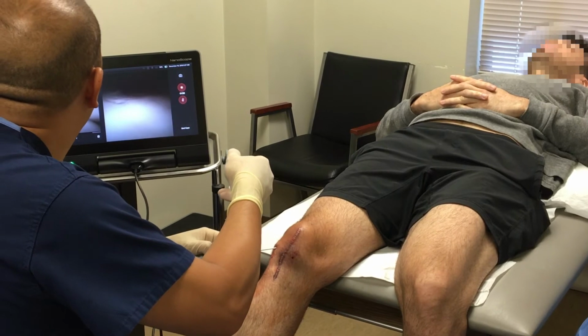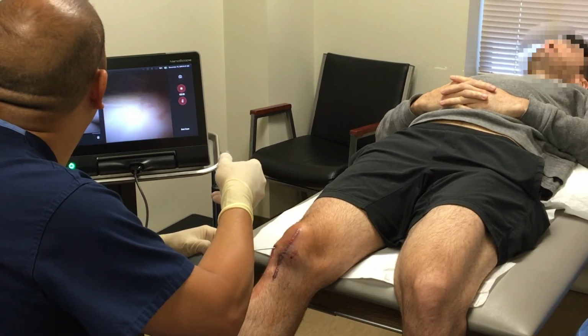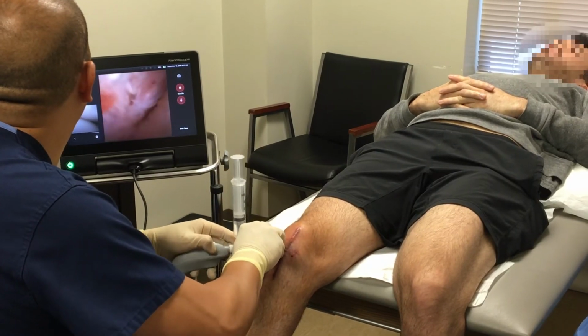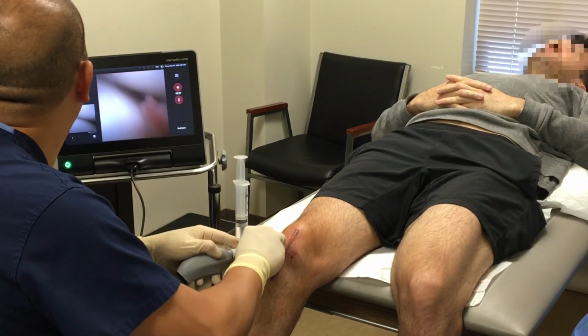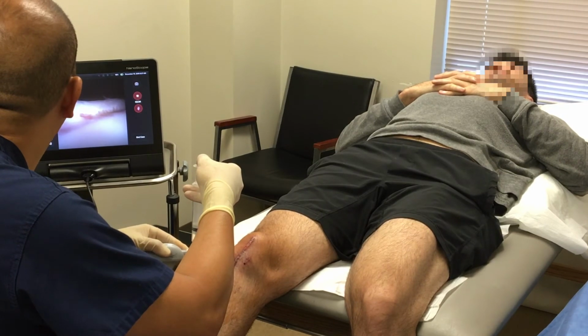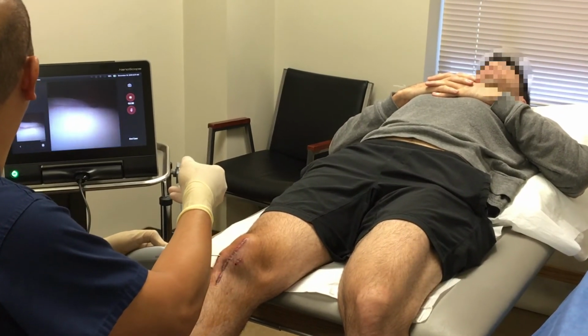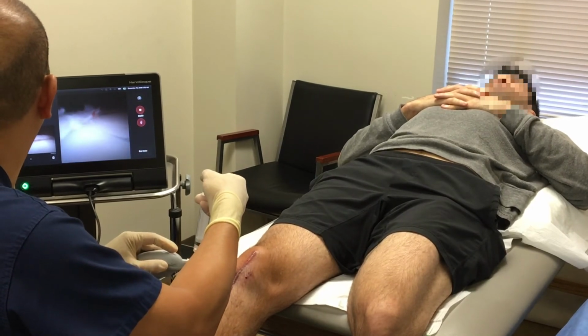The OATs plug itself is well maintained. This is the trochlear groove edge. Oftentimes fat can interfere with the NanoScope, and therefore you must insufflate with fluid. This looks like a well incorporated edge of the OATs. The cartilage looks well maintained.